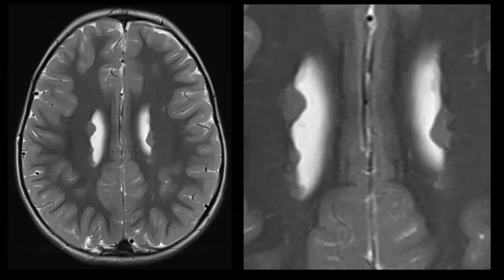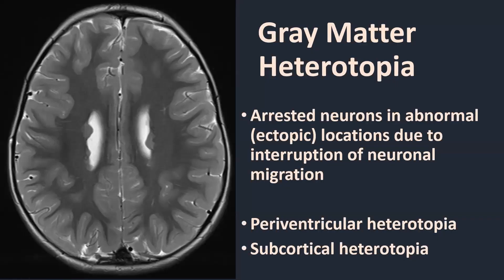This patient received an MRI the next day, which confirmed the finding of subependymal nodules protruding along the margin of both lateral ventricles. On these T2-weighted images, these nodules have the same signal intensity as the cerebral cortex. We are dealing with a gray matter heterotopia — basically the presence of neurons in abnormal locations because the normal process of neuronal migration was interrupted. Most frequently we find these islands of abnormal arrested neurons along the ventricular walls, and we call those periventricular heterotopias.